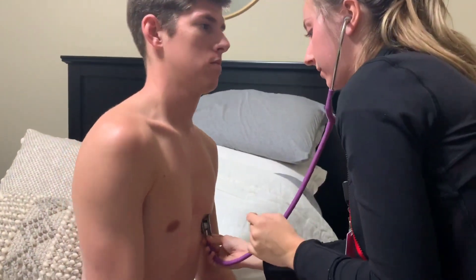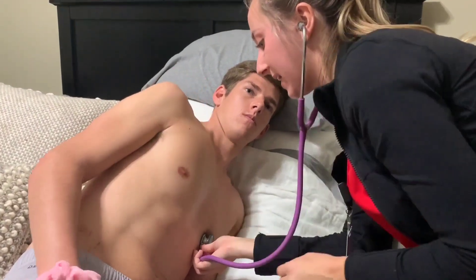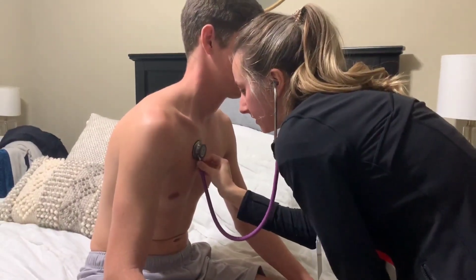If you could just lay laterally — we're listening for any S3 sounds. You can get back up. Now if you could just lean forward for me, we're going to listen for any abnormal sounds here at the base.